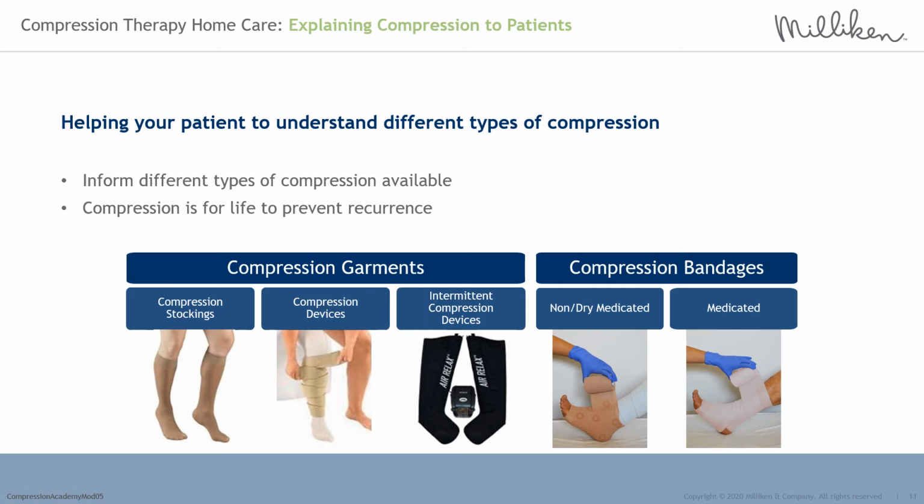Dynamic devices. Some patients may be offered the use of dynamic compression devices, particularly those who are working in roles where compression bandages would be hazardous or they are unable to make clinical visits as frequently as required. The device affords convenient treatment schedules where the compression is used. This is also reliant upon the patient using the device as prescribed.